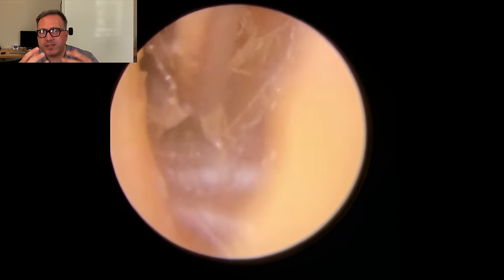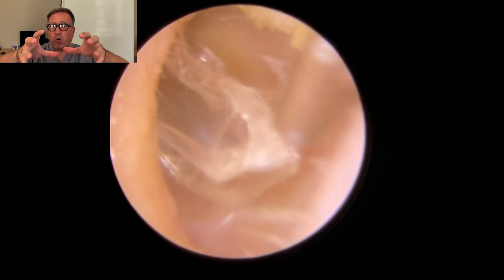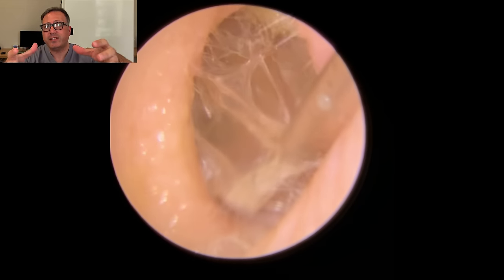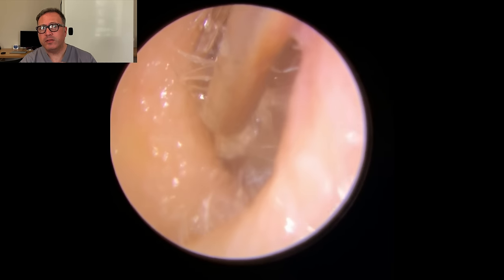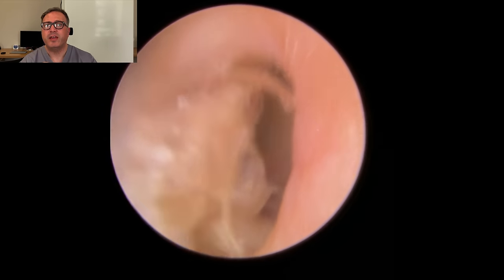Need to get a grip in that central section again there. Really hold on to it. It's pulling all of that sheen skin off the canal wall there. Really kind of taking it all out in one go. Look how that's coming away. I've really slowed the video down so you can get a good look at it.